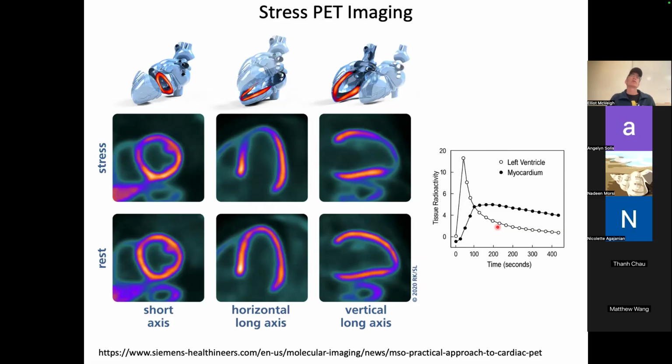So if somebody has a very weak heartbeat, that their ejection fraction is only 25% versus somebody that's 60%, you can imagine that the rate at which the blood itself comes to the left ventricle and exits the left ventricle is a lot slower, right? So it takes twice as many beats. Each beat, a much smaller amount of contrast gets moved. So you need that input function in order to convert this function, which is in the tissue, into absolute flow measurements.